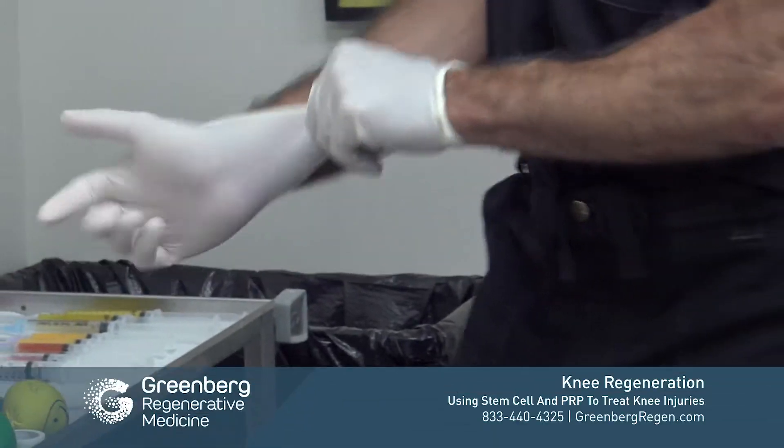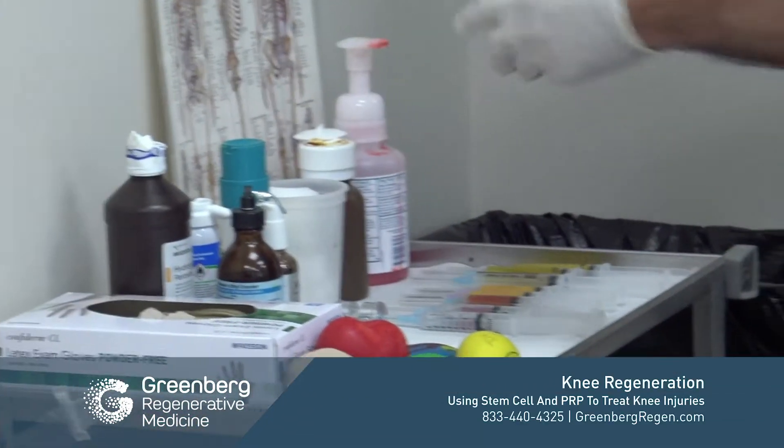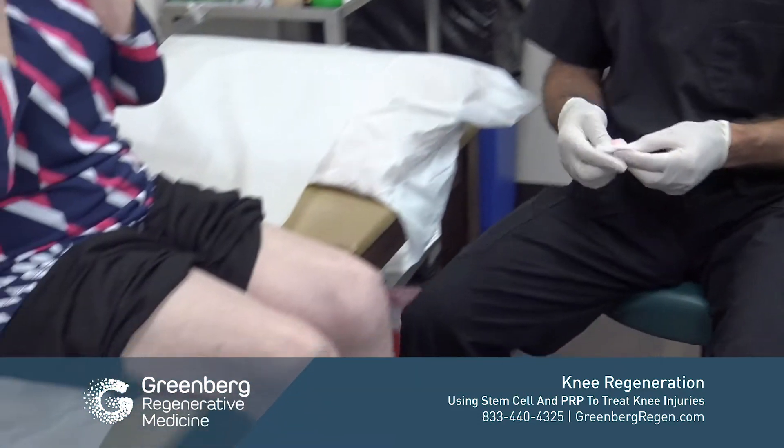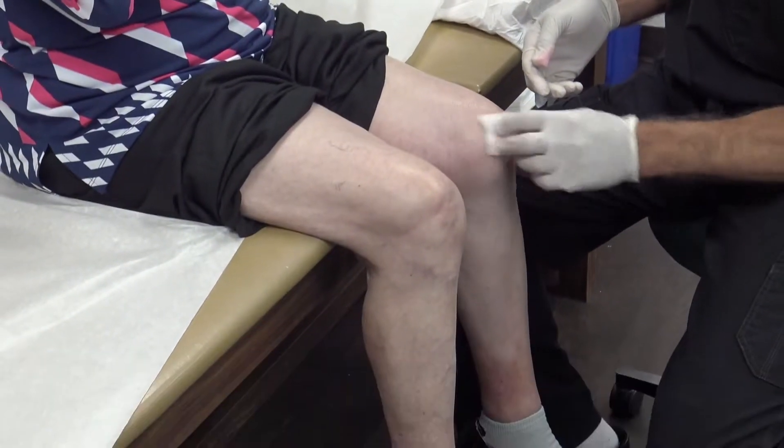The first part of our procedure is going to be cleansing the patient. This helps to kill any pathogens and reduce the risk of any infection.